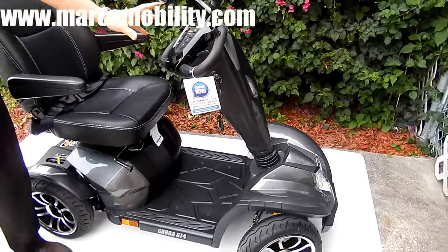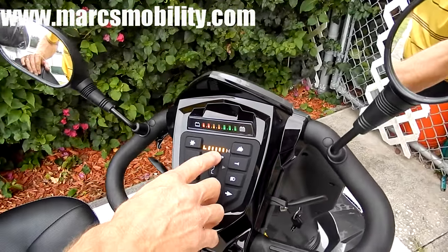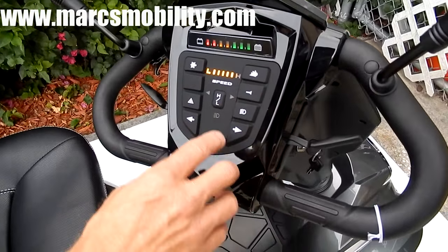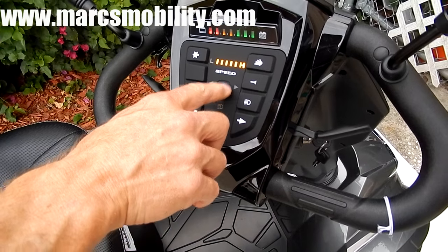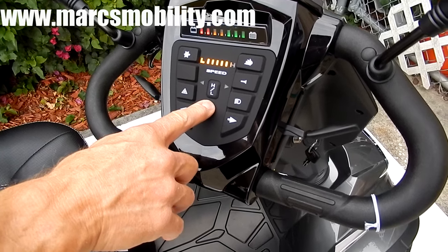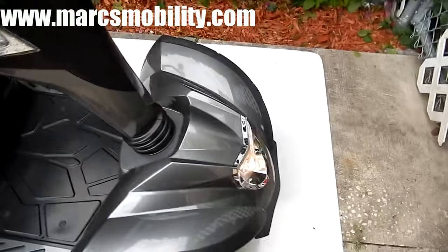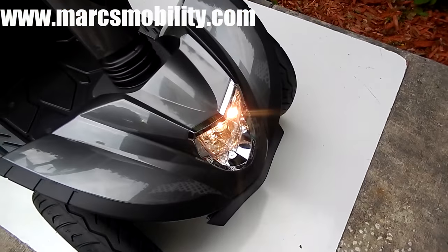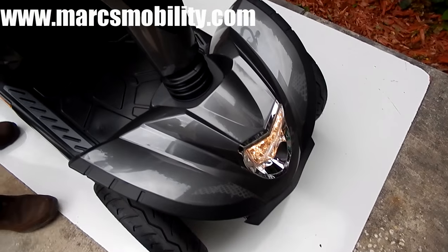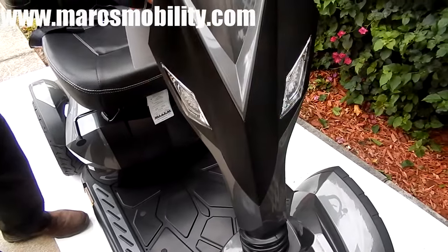If you look at your dashboard on here, you've got mirrors, and you've got high speed and low speed. If you hit this, you'll be at high speed — you can see what it says: high. This would be the low speed, so you can drive it at a slower speed. It also has great headlights in the front and great headlights in the back.